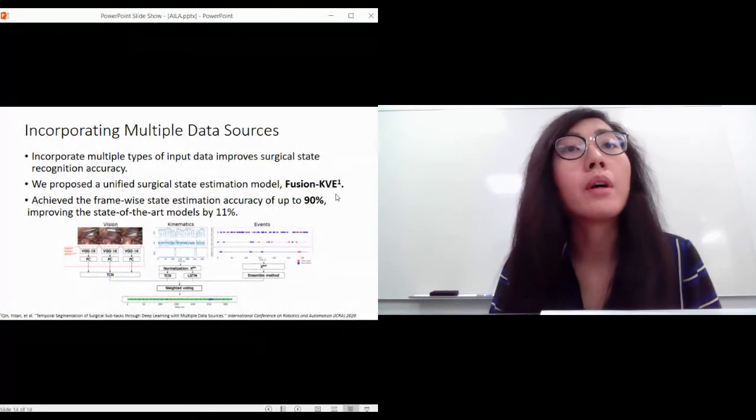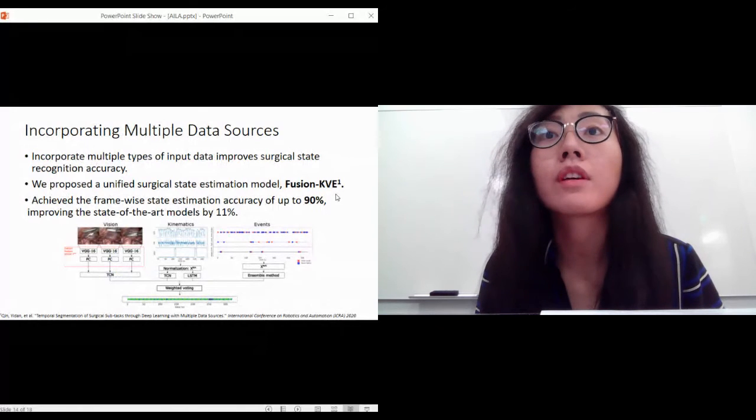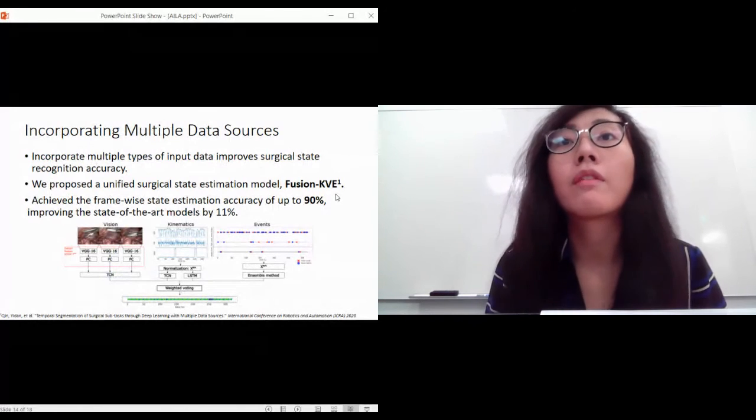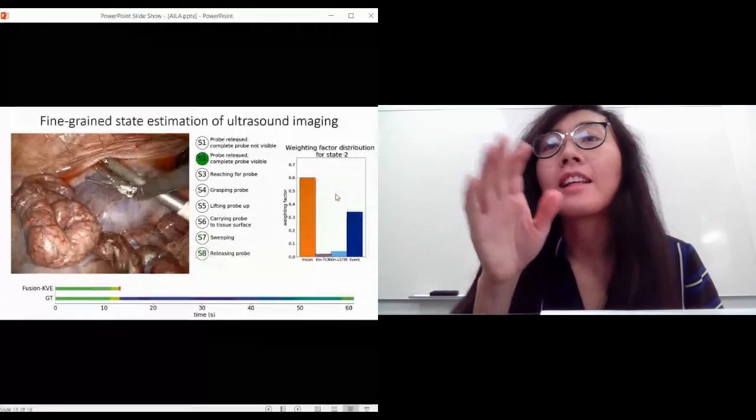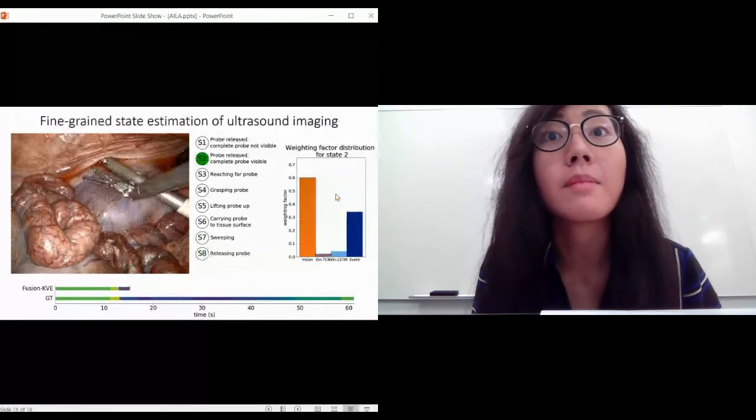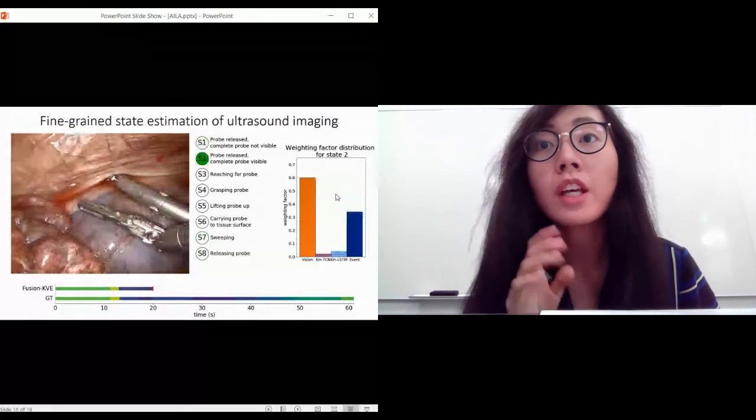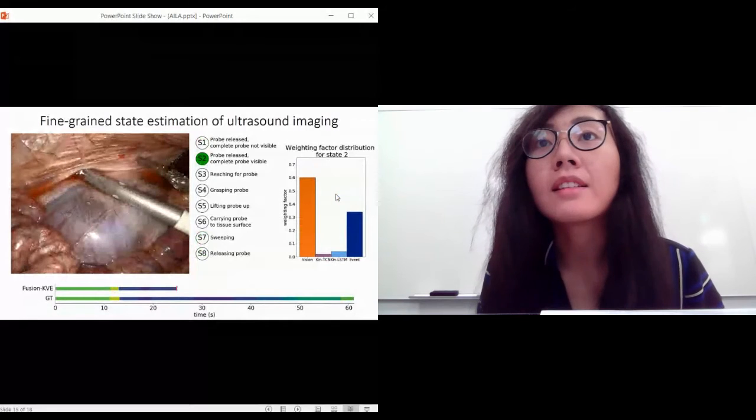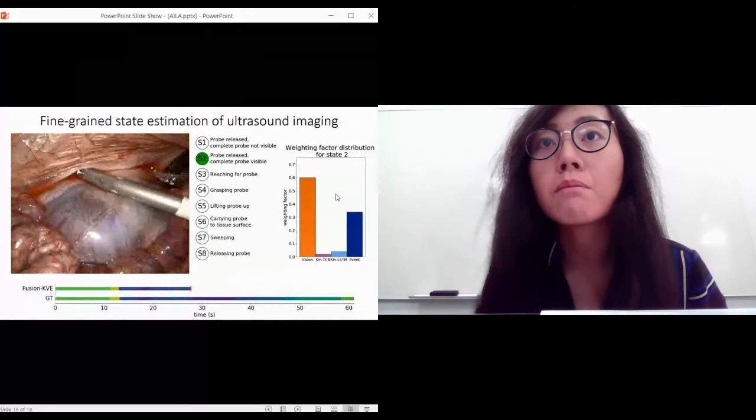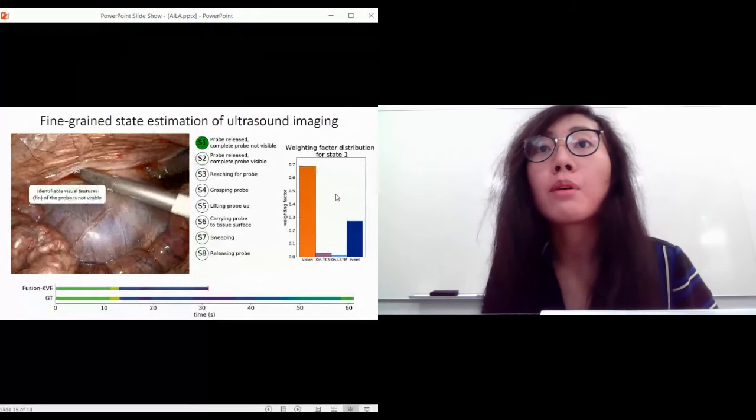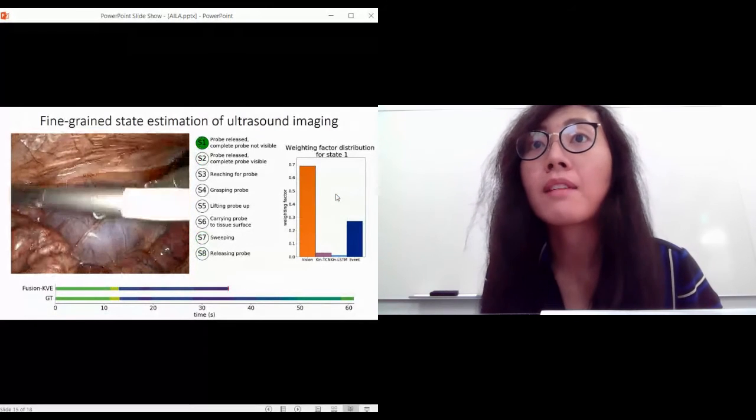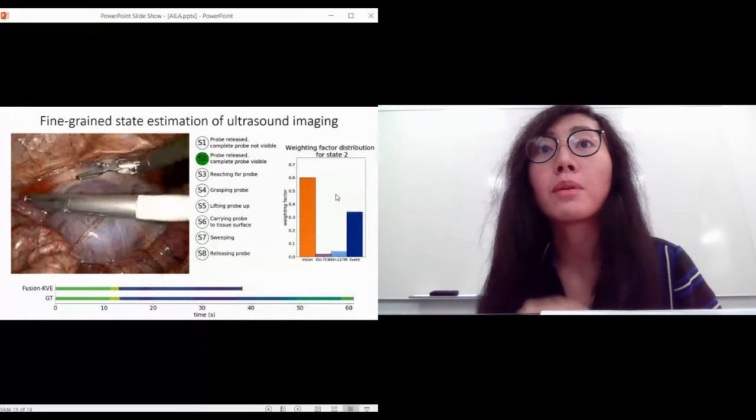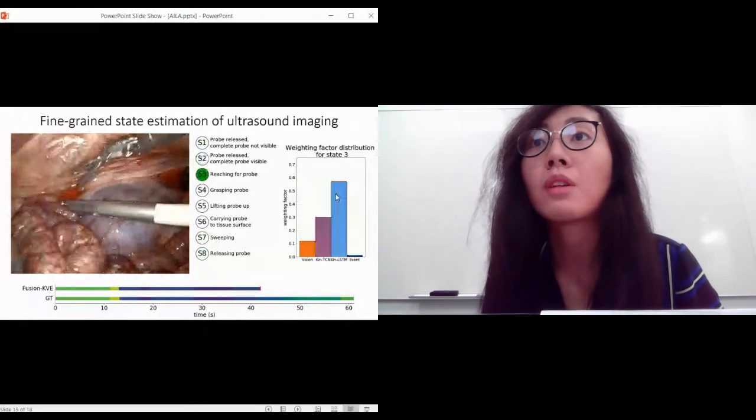We show a demo of our model Fusion KVE at work here on ultrasound imaging data. This is still a very complicated scene, and in the bottom we have the slider indicating the current state as estimated by Fusion KVE compared to the ground truth. We can notice here that the fin of the ultrasound probe is getting immersed into the tissue, and the identifiable visual feature is lost, which is why the current surgical scene as seen by Fusion KVE is that the probe is not visible. Now the fin is back visible, and we change to state two.